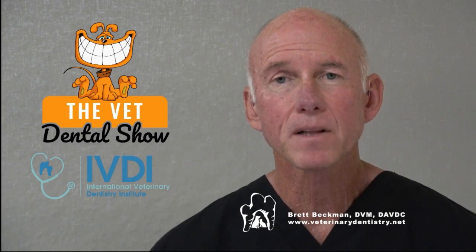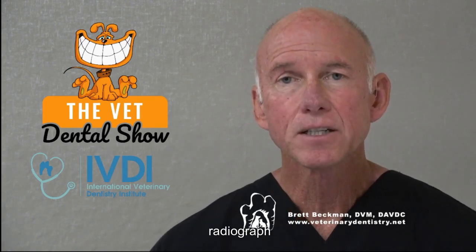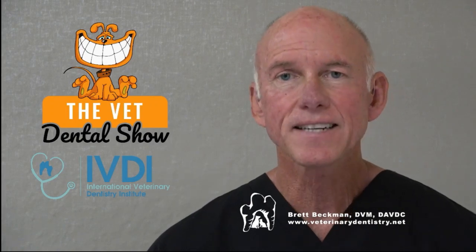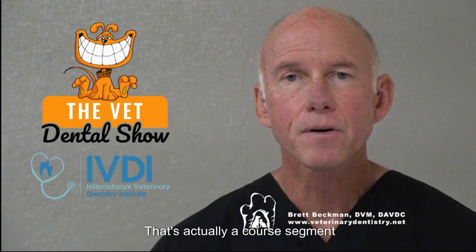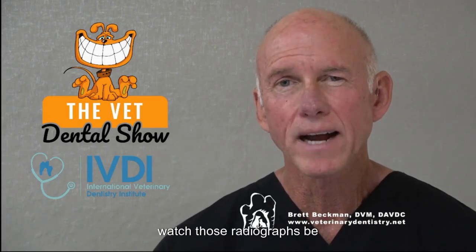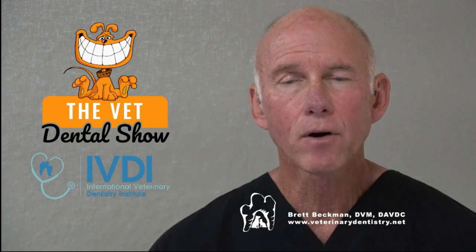And then do those radiographs first, because what that means is you've got all of the indications on that radiograph, with few exceptions. They're going to dictate what extractions you're going to be doing. That's another podcast in itself. That's actually a course segment in itself, because it really takes radiographs to be able to walk through that, and be able to watch those radiographs be described, and arrows pointing at the level of bone, and all of the parameters that are needed to make those decisions.